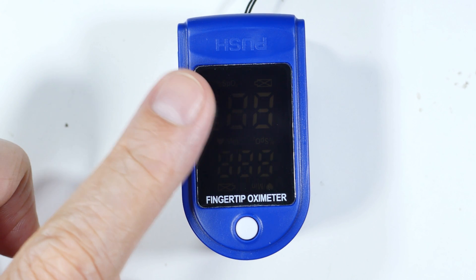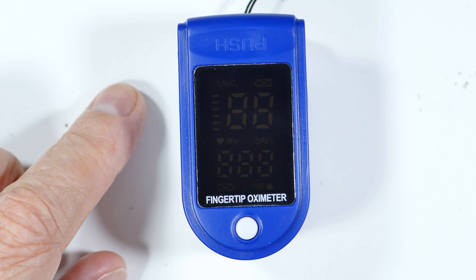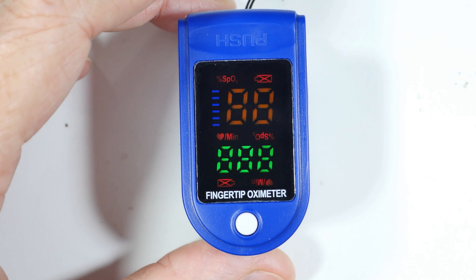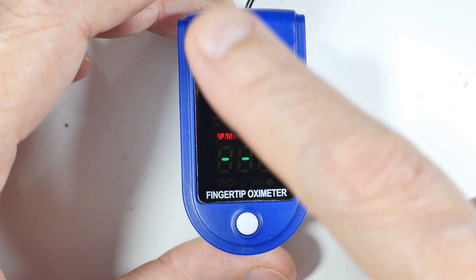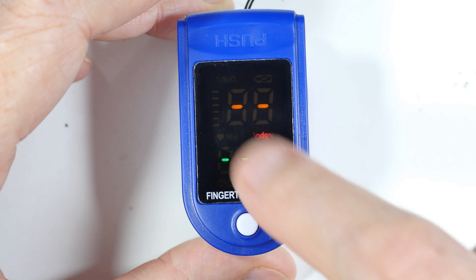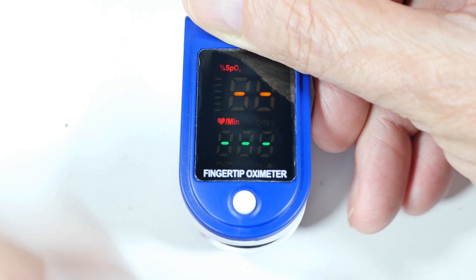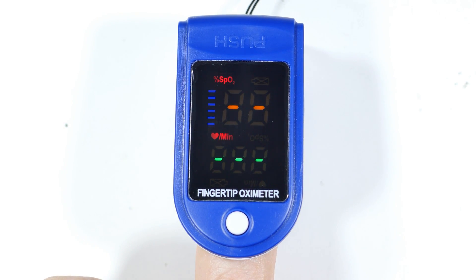I bought the cheapest fingertip oximeter I could find online — about three bucks with shipping. As you can see, it's got a color readout and it will do inverted or regular readouts, which is the only feature it has. To use it, you put your finger in here; it works a little bit like a clothespin and it gives you the readout.